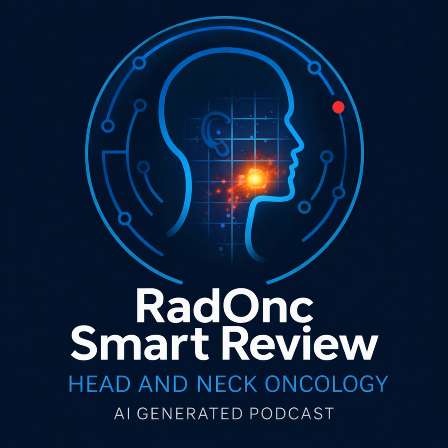Precisely. You might have trismus, or the fibular flap reconstruction is just so bulky there's no room. So we have to be pragmatic. We have to ensure the setup is reproducible, even if we can't get that ideal organ at risk separation that a bite block would give us. For imaging, we absolutely need a CT with IV contrast.